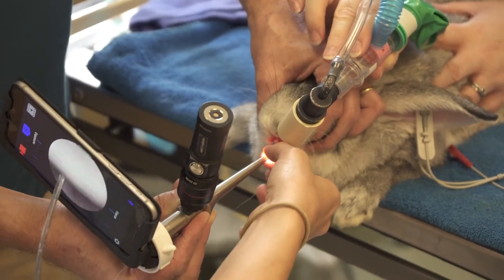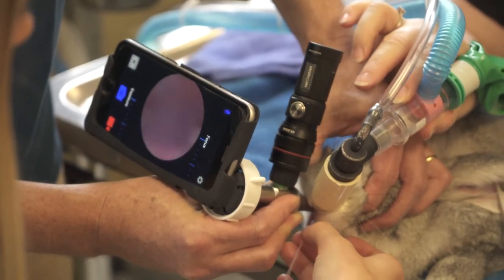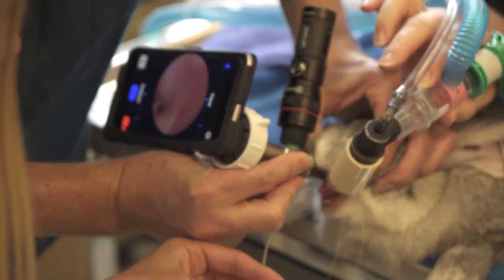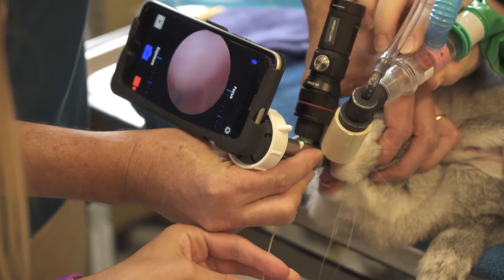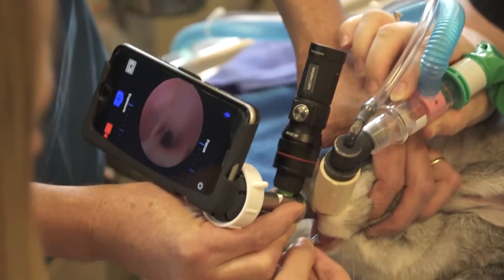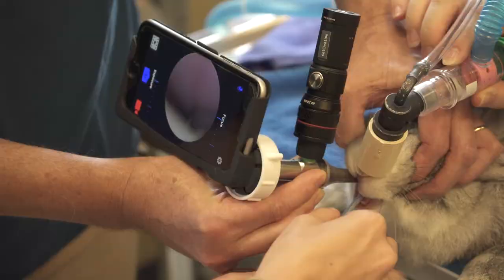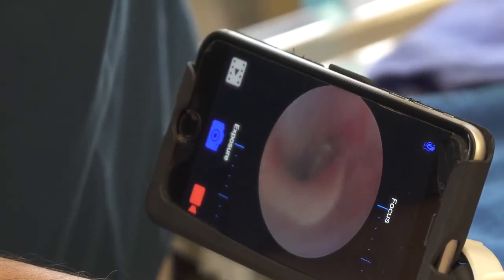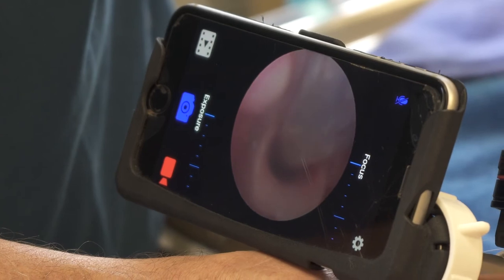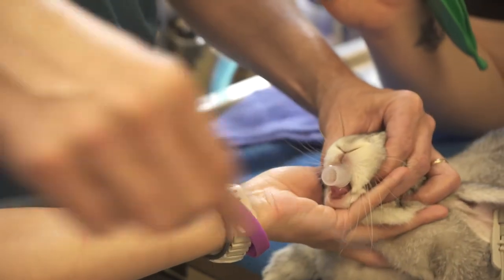Now it's time to start watching the screen instead of the bunny. I'm going to follow your tube in. Okay — you just intubated. Keep going. You're meeting resistance — do quarter turns. You're intubated, completely intubated. Can't go any farther.